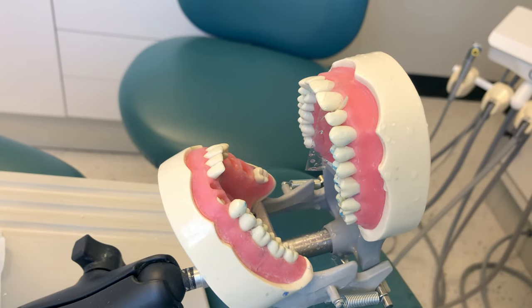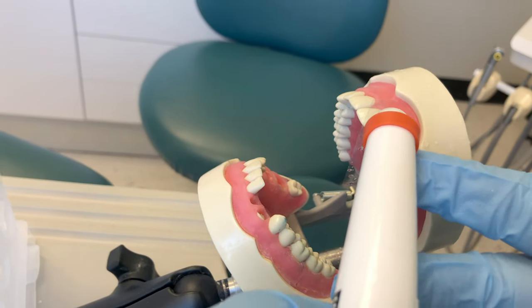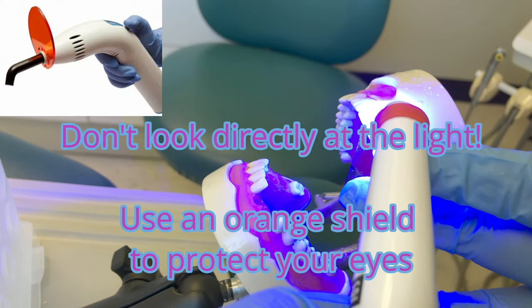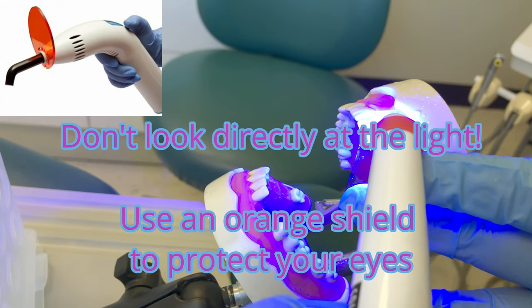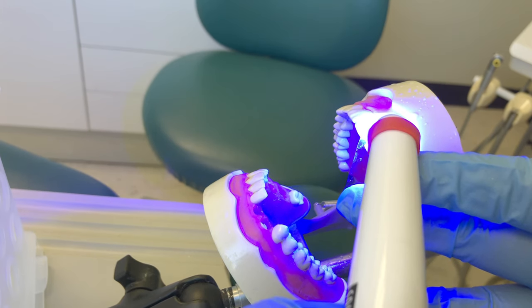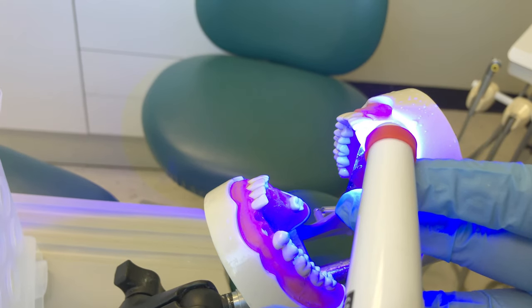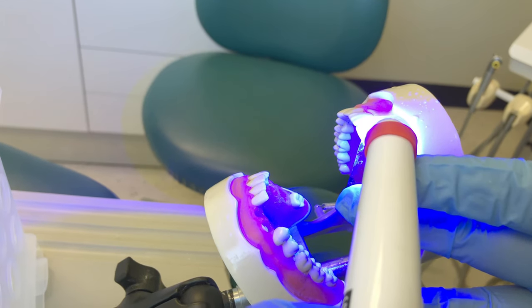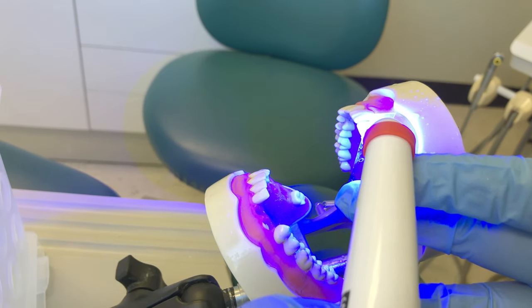This gets passed to the doctor. After the doctor places the bonding agent, we can light cure. This material needs to be light cured for 10 seconds — the curing light will beep after every 10 seconds. It's good practice to stabilize your light and get it close to the tooth without touching it.